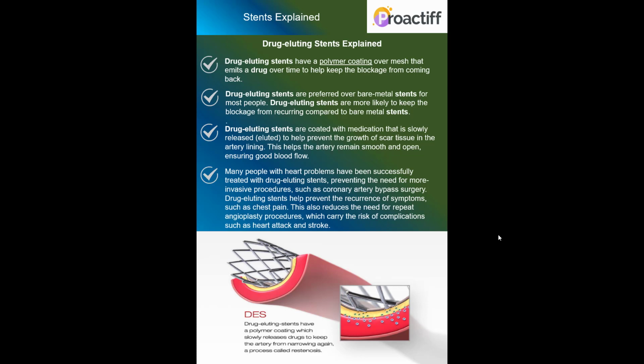So the drug percolates over a timeline, mainly for drug purposes. Over an extended time, the drug would percolate through the system, and this would give the right dosage and the effect that's needed so as to ensure the blockage does not happen again. So the extended release mechanism is a subset of the stent that is being inserted.